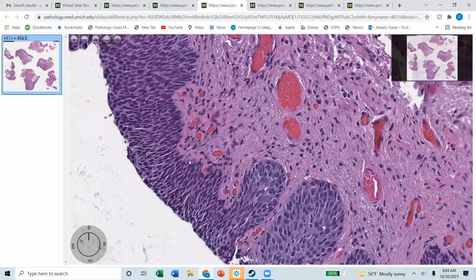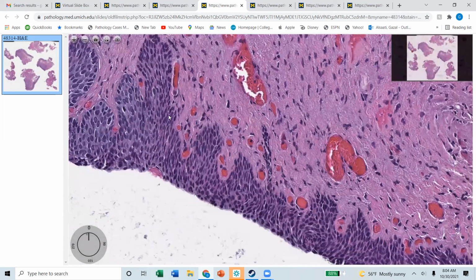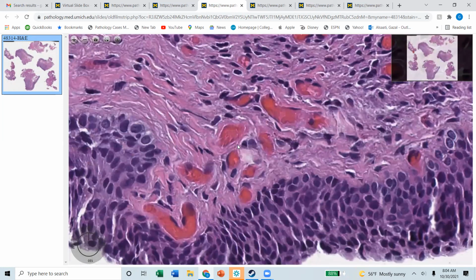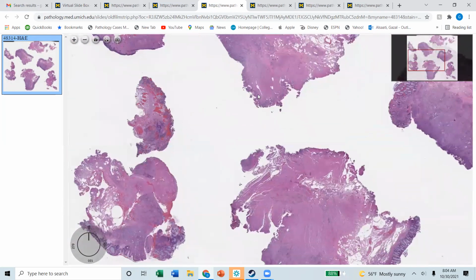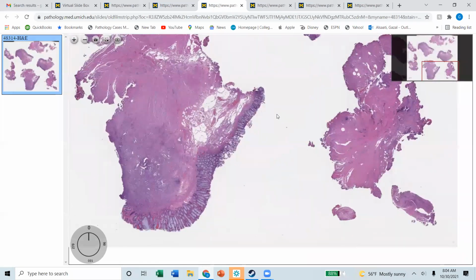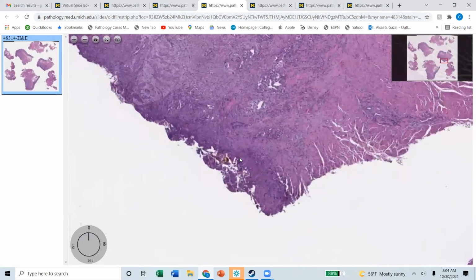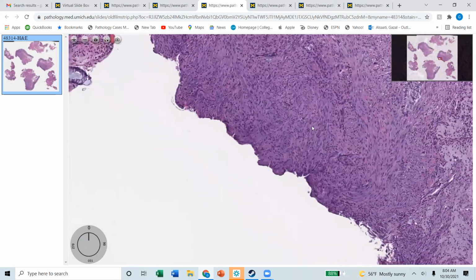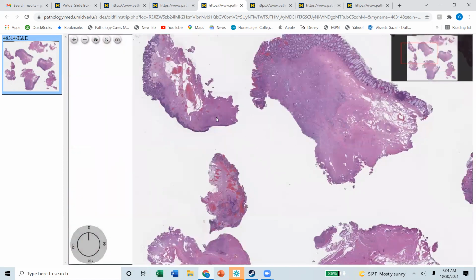It's not something that I would rush through. It's probably going to stay on my desk for like 2 days, screening it. But I need a better squamous component, and they don't have it here. So the only one is the one we were looking at at the very beginning, this one.